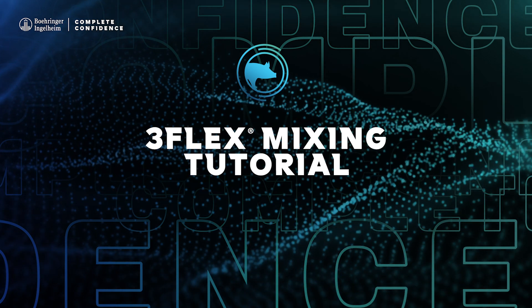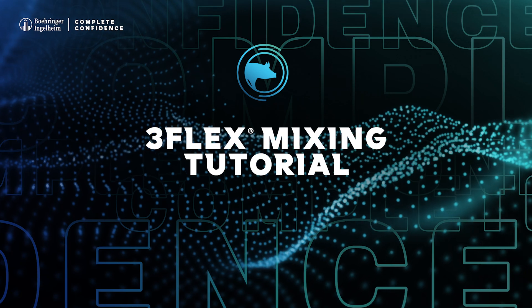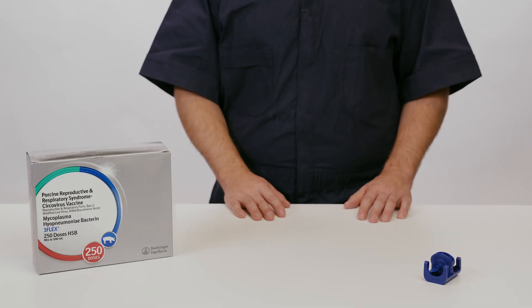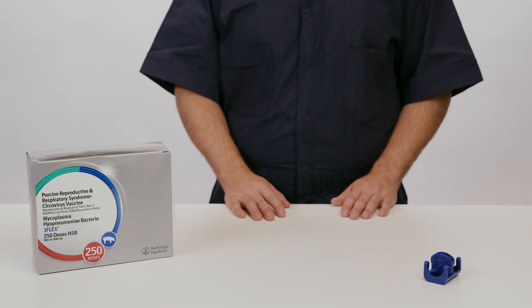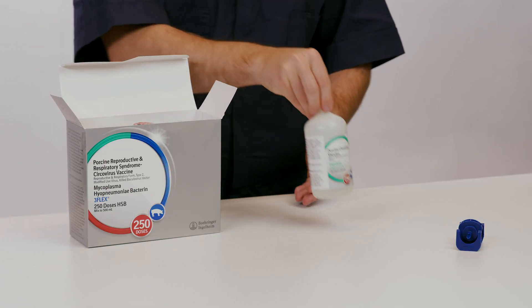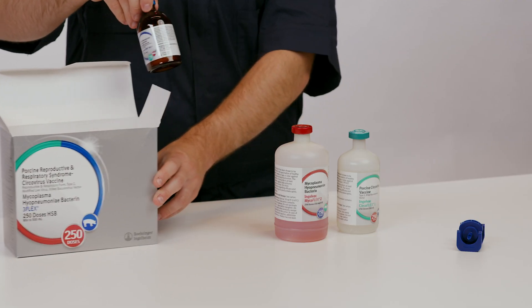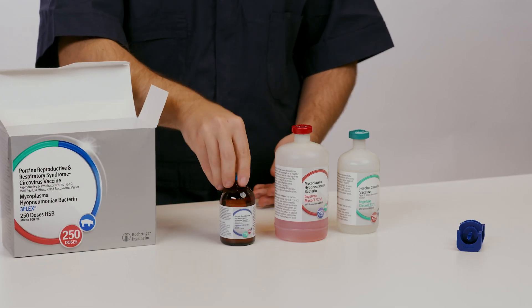Welcome to the 3Flex mixing tutorial video brought to you by Boehringer Ingelheim Animal Health. To begin, make sure that you have a vented transfer spike along with your 3Flex box, which includes one bottle of each Ingelvac CircoFLEX, Ingelvac MycoFLEX in a headspace bottle, and lyophilized Ingelvac PRRS MLV.